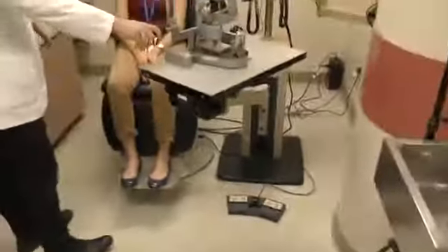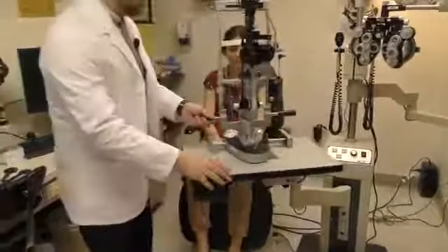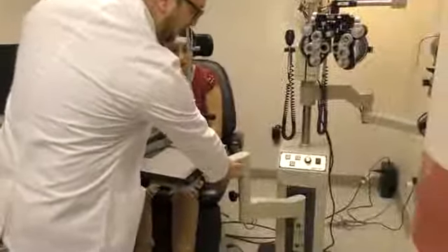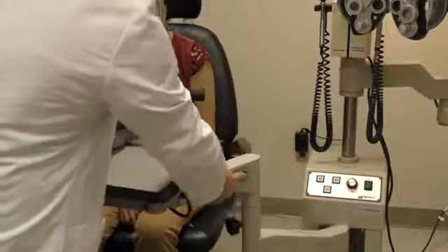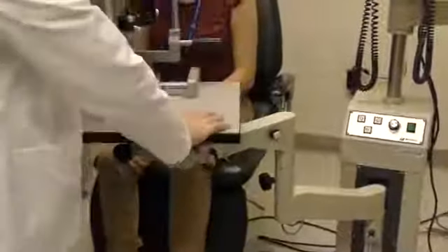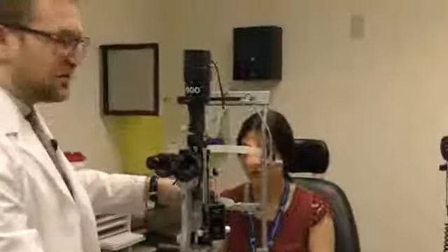Alright, good. So now we're actually going to show how to raise and lower the arm of the slit lamp. As you bring the slit lamp closer to the patient, there's a button on the side of the slit lamp, and if you push that button and hold it down, it releases the arm so you can raise or lower the arm. Okay? So what you want to do is have everything set up so that the patient is able to put their forehead against the bar and their chin in the chin rest, okay?